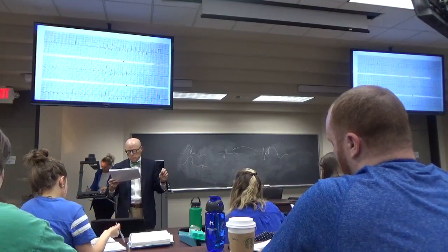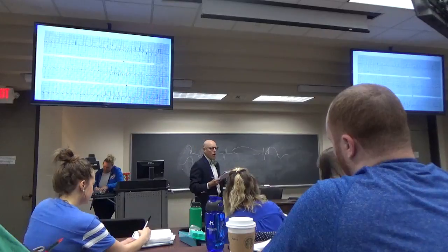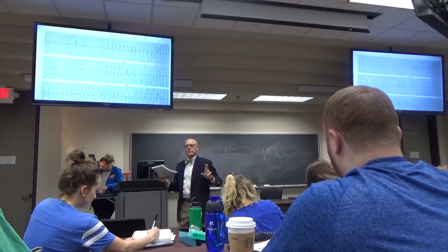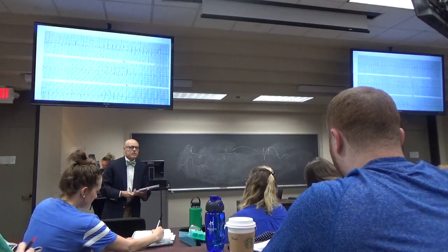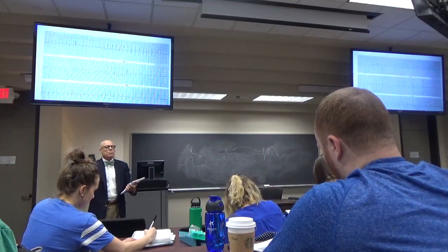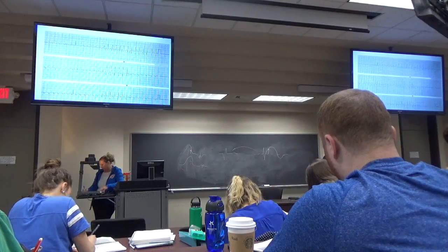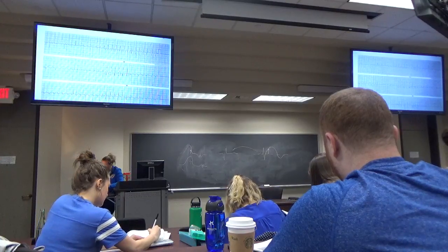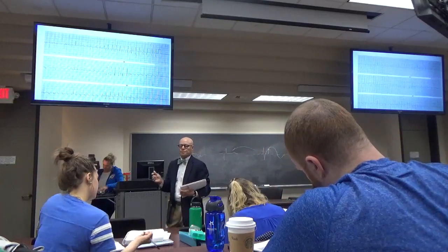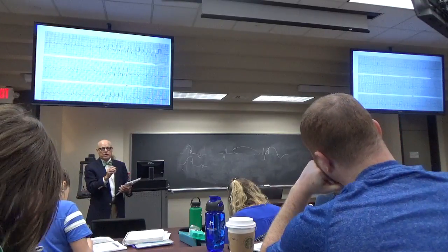Is it? I got 150. I got 150 as well. So would you call that flutter? I call it flutter. I call every EKG I see with a rate of 150 flutter. And the reason I do that is you can't tell necessarily what the rhythm is on the EKG, but it's much more likely to be atrial flutter with a 2-to-1 block than it is to be sinus tachycardia. So I call everything that's a multiple of 300 with multiple P waves in between atrial flutter. So I think the rate is more like 150, probably atrial flutter with a 2-to-1 block.